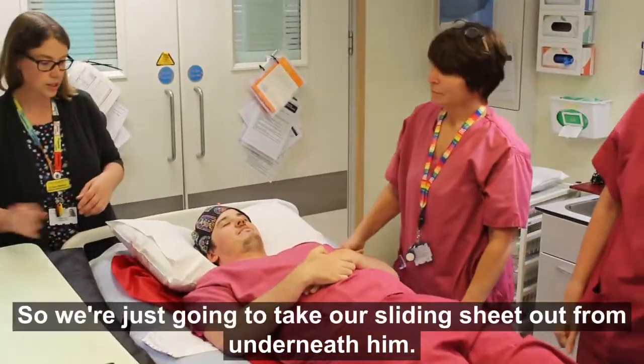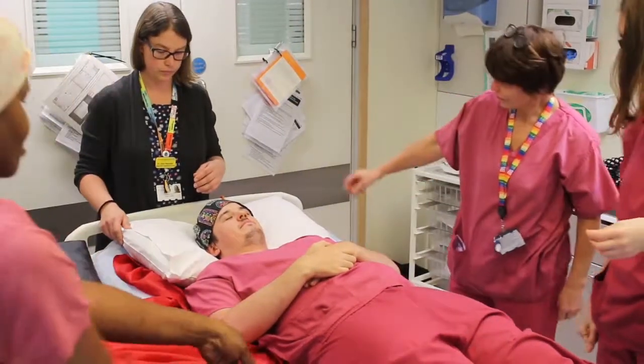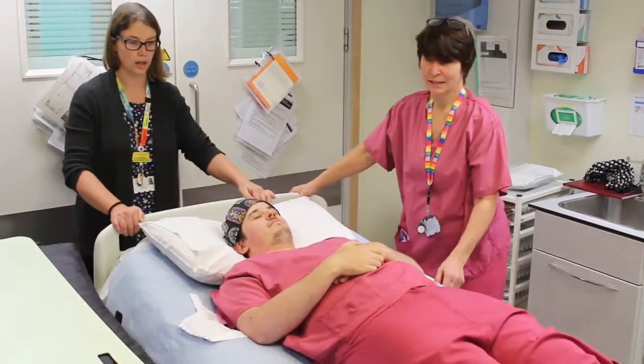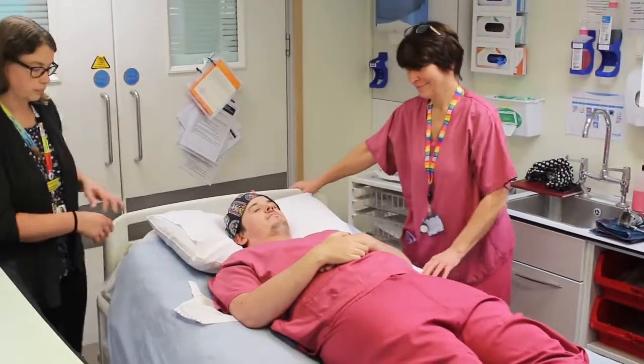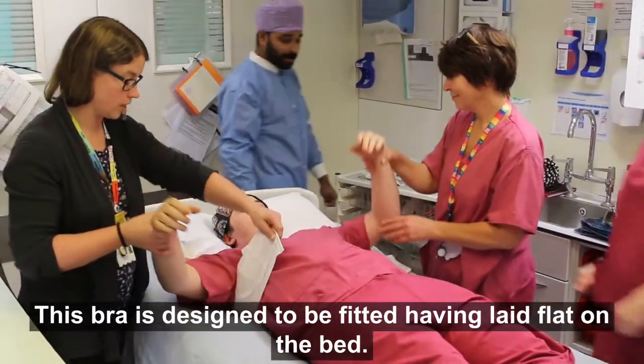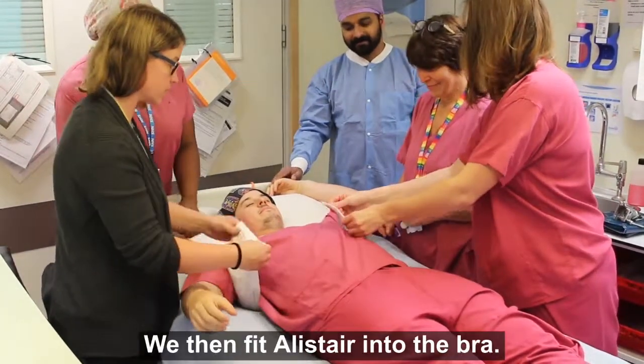We're just going to take our sliding sheet out from underneath. This bra is designed to be fitted having lain flat on the bed. We then fit Alistair into the bra.